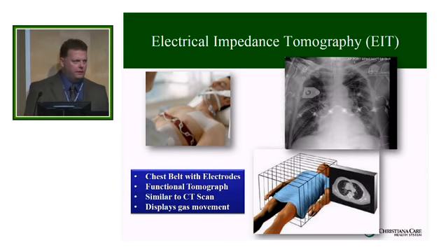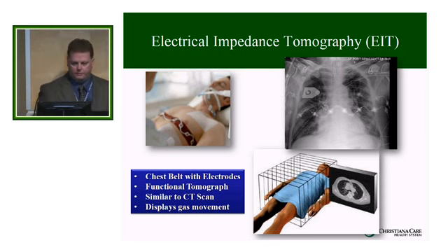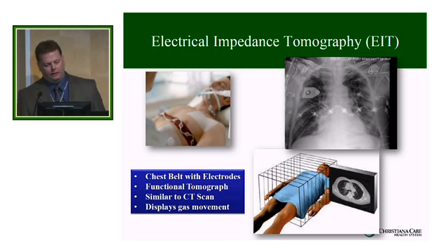One of the most interesting things that I like, and then I'll wrap this up real quick, is something we got the chance to use: electrical impedance tomography. We were able to get a view of this with a prototype device before it's been FDA approved. And what it is, it's actually a chest band that goes around a patient. We accidentally left it on for an x-ray, so I think that's kind of cool to show you where it goes around, because we're really aiming to take it off. We don't want to obstruct any imaging. But that's what it looks like on the outside of the patient.